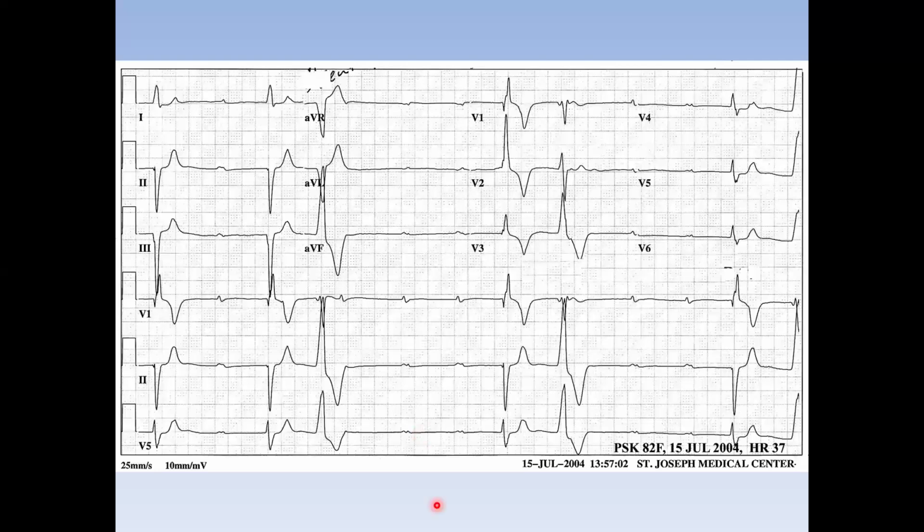Yes, absolutely. So if there is intrinsic conduction of fib waves, electrical activation from the atrium to the ventricle, the RR interval is going to be irregular, even in the setting of slow ventricular response. And if they're on medicine, we stop it and wait and see what happens. But if they are not on medicine, then there is probably bad AV conduction. And eventually, a lot of those patients end up needing a pacemaker. If somebody has a heart rate of 35 with AFib, without any AV node blocking drug, they have probably higher grade AV block.